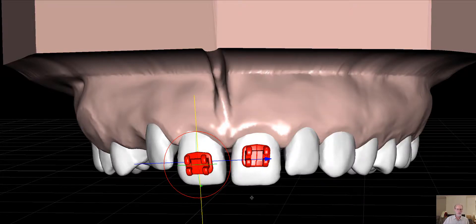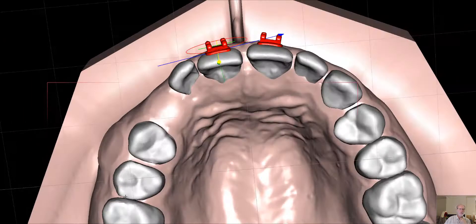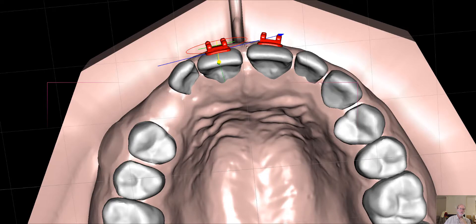Here are two ways of positioning the brackets. This is the central incisor. As we looked before, you want to have the bracket positioned in the center of the tooth.